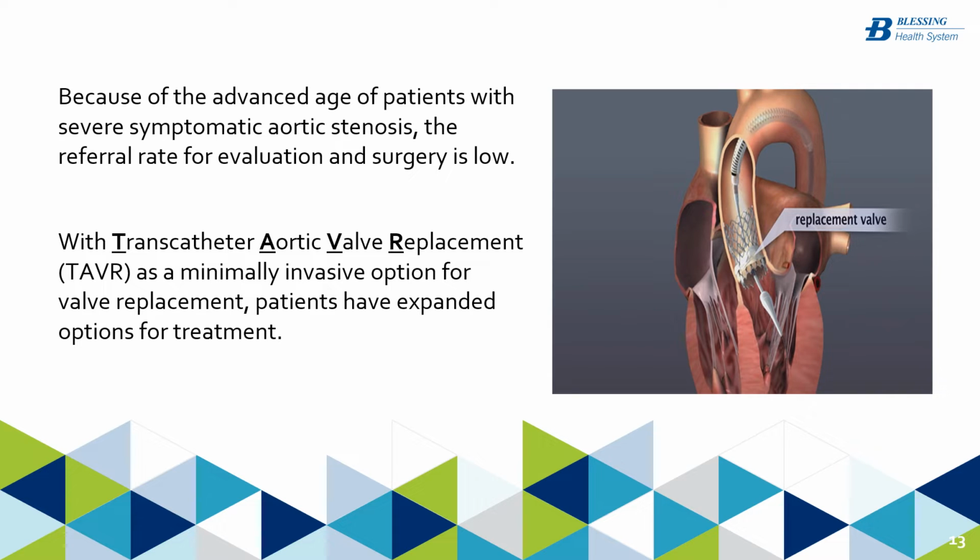This was developed 20 years ago for patients who had no option for surgery. They were either too old, too frail, or had too many comorbidities, so it was designed for inoperable patients and high-risk patients. Over time, it has proven to be an effective therapy, and so we now have indication for low risk, moderate risk, high, and inoperable risk patients.